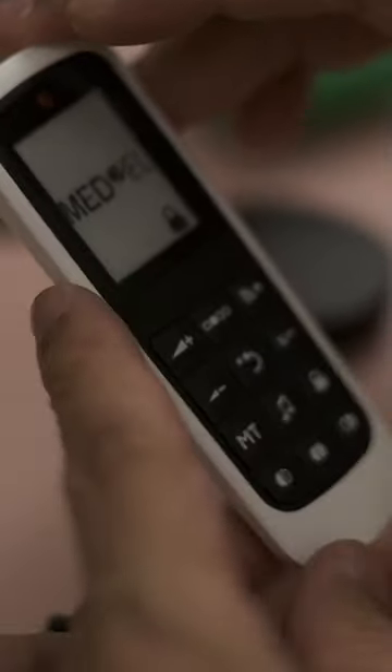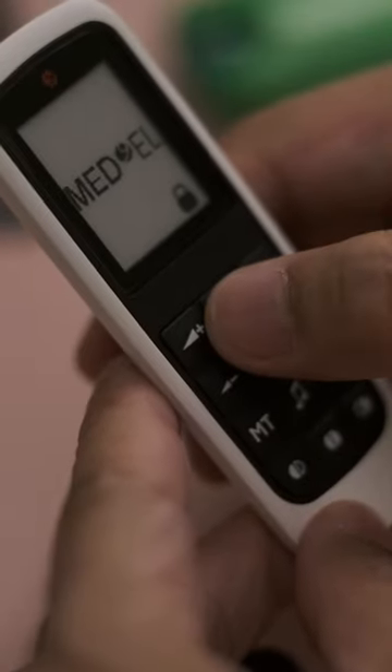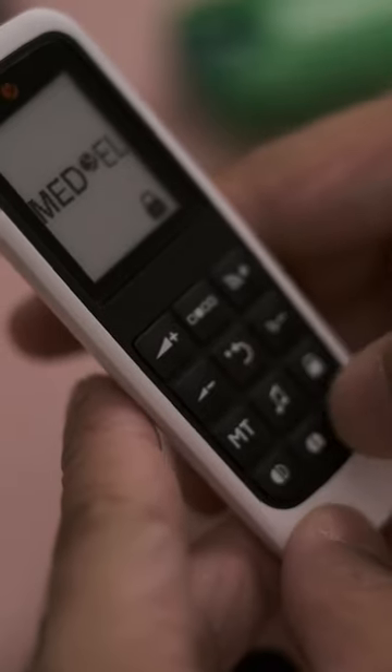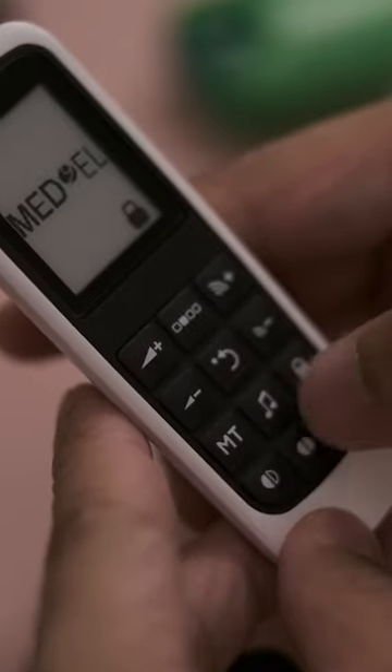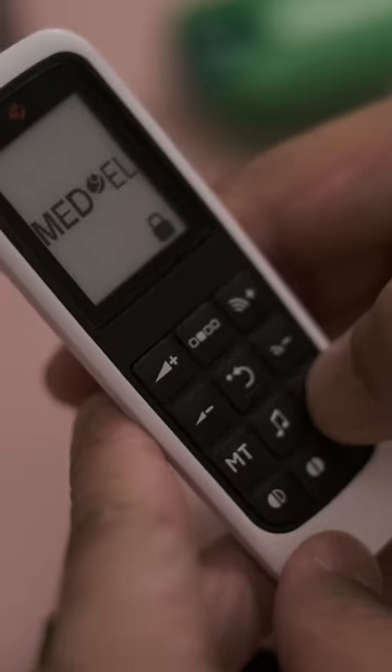Part 2 of How to Use your FineTuner Echo. The FineTuner Echo has a Telecoil button, a Data Streaming button, and a Lock button key.